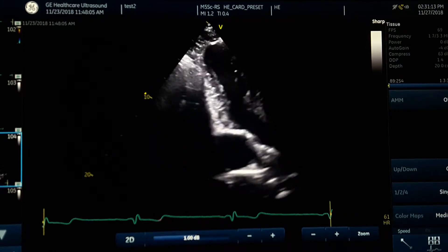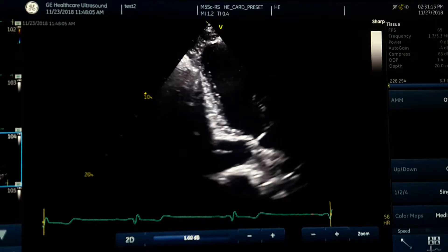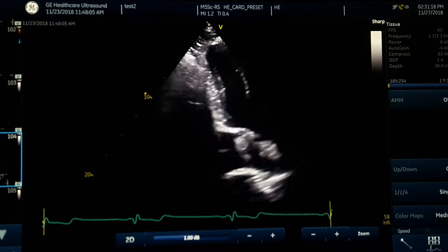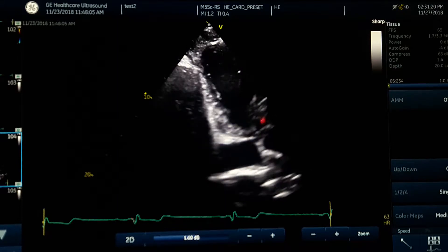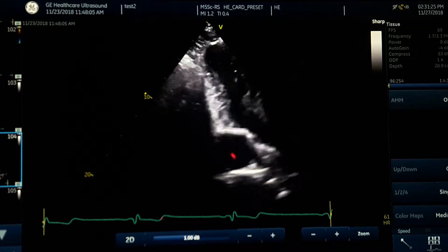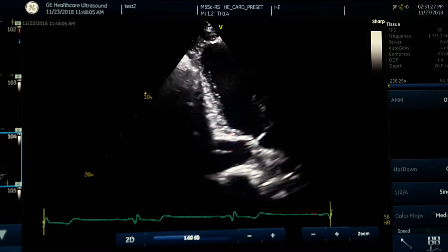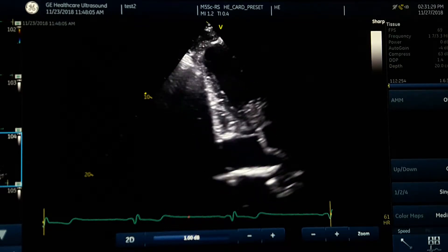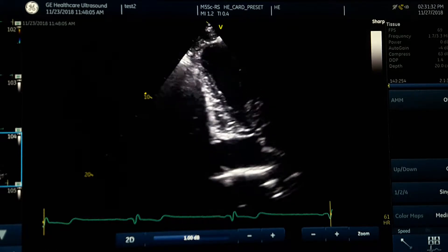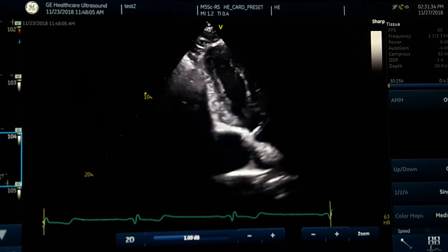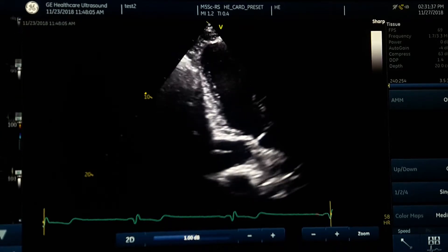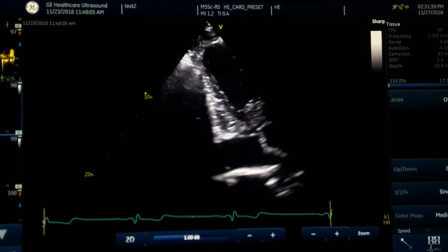Look at this image. When I am twisting, if I fan up toward the roof, you will see the aortic valve show up but I lose the mitral valve and left atrium. So I know I am fanning up at this level. I just fan down, continue my twisting, and I can get a nice Apical 2 chamber image.